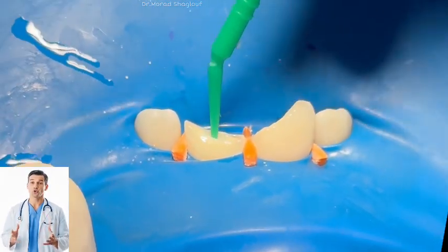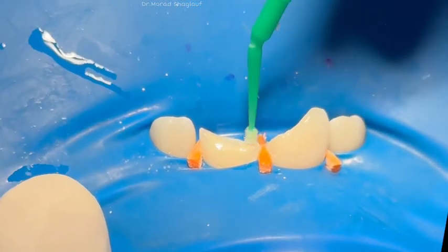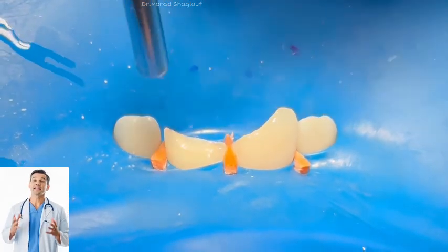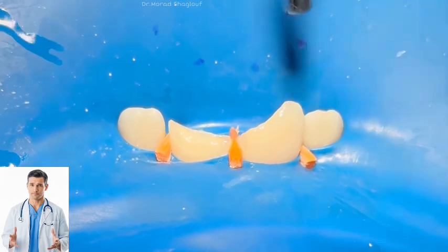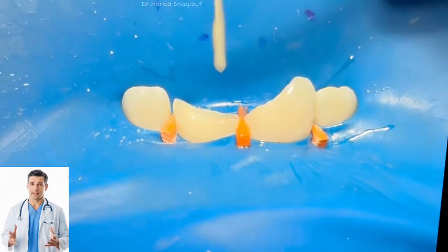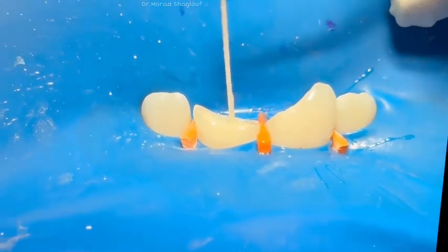Anterior restorations require both functional strength and natural appearance, especially because these teeth are highly visible during speech and smiling. After shaping and finishing, the tooth is prepared for the final restoration. The result is a reinforced anterior tooth with improved strength, stability, and appearance.